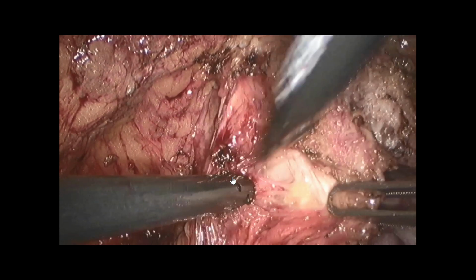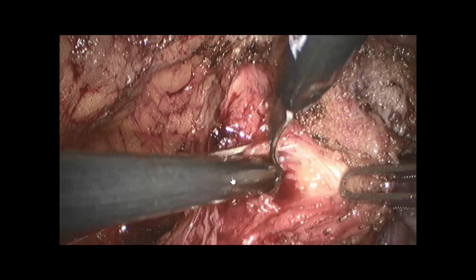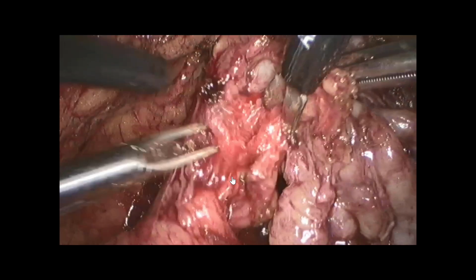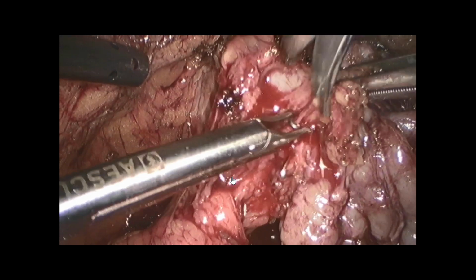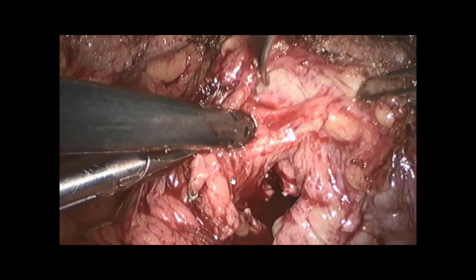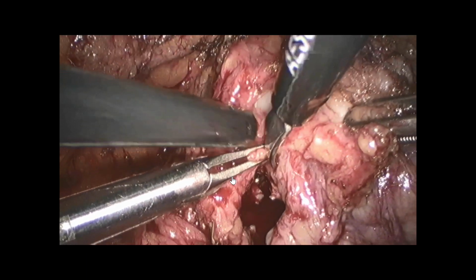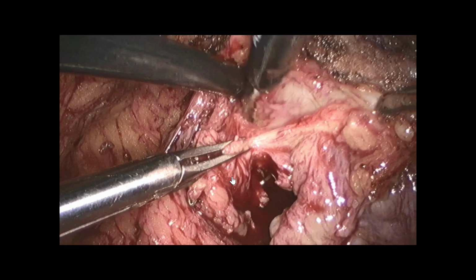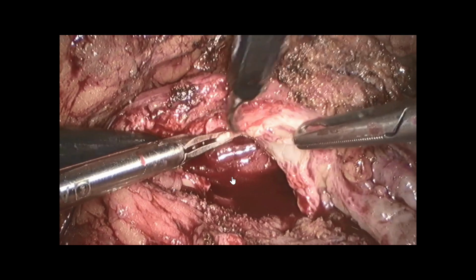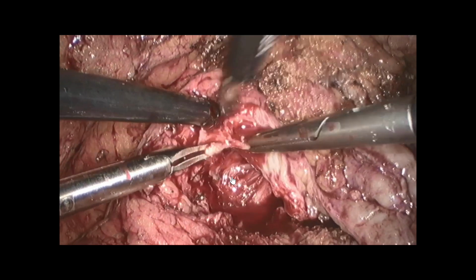And now my assistant will place the clip. So I will just place my scissors to say, okay, go there. You see, I place my scissors, she knows, she comes, and we are working together. I am doing the exposition with my right hand, with the grasper, okay? And you see now, I am placing in front of the scope what I want to do. So immediately we go, and you see that now it's really effective.